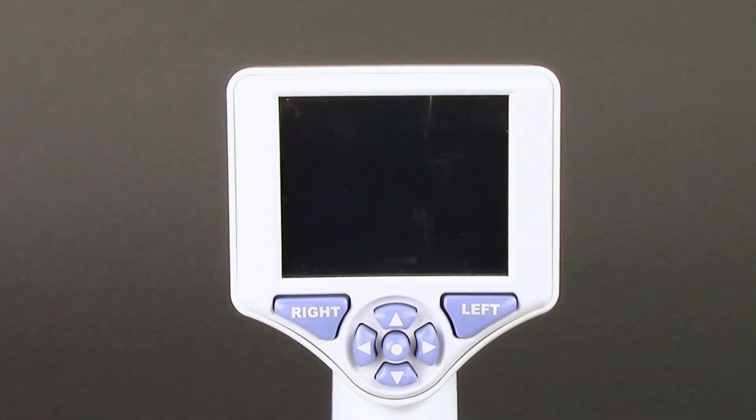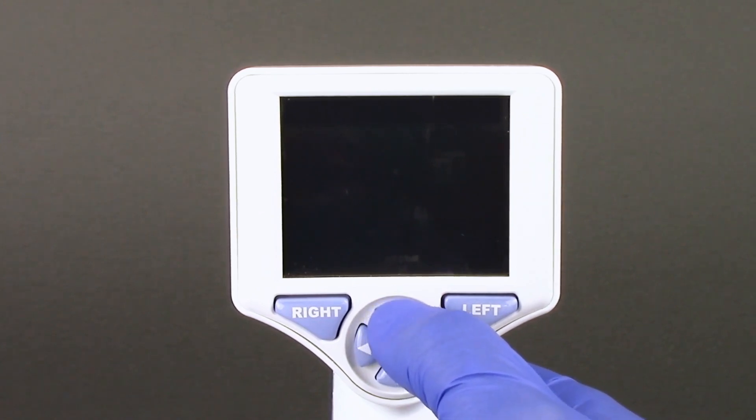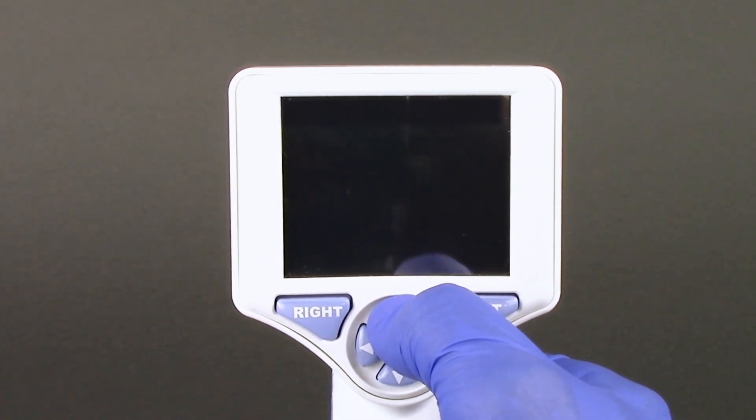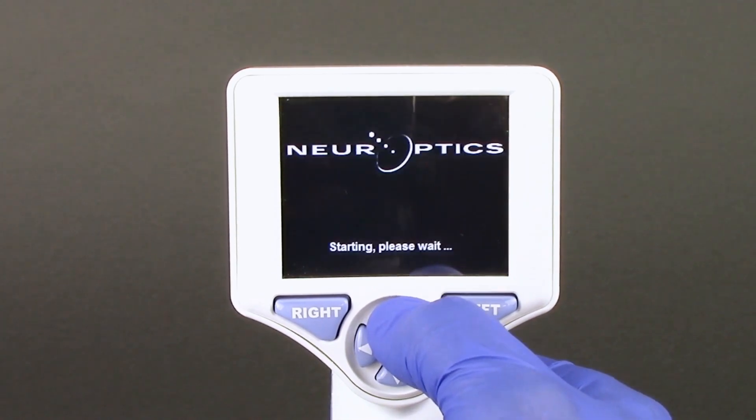If the NPI 200 is left off the charging station for longer periods, the pupilometer will power down after 30 minutes. To turn it back on, simply press and hold the up button for a few seconds or return it to the charging station.